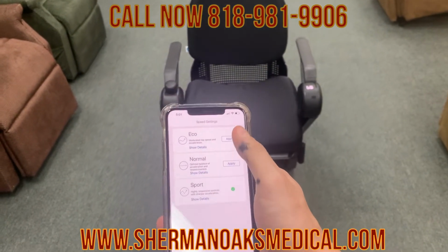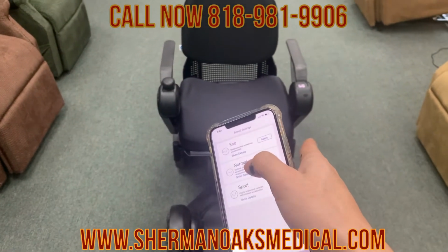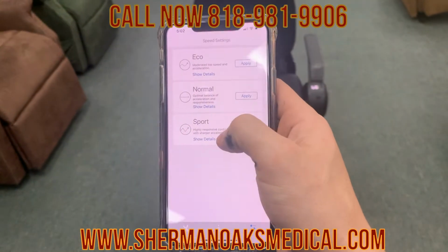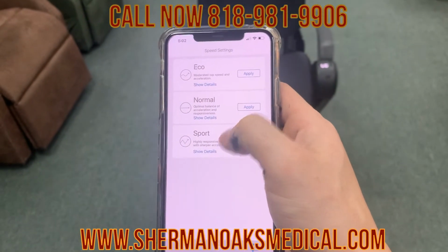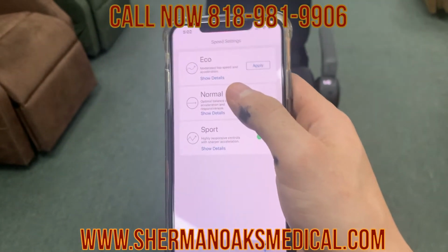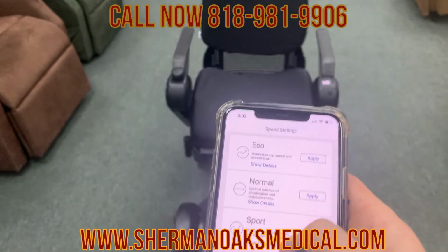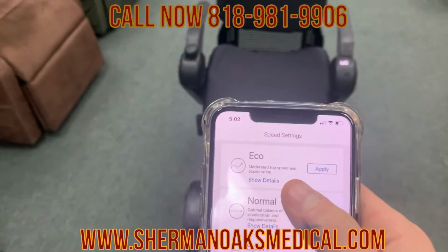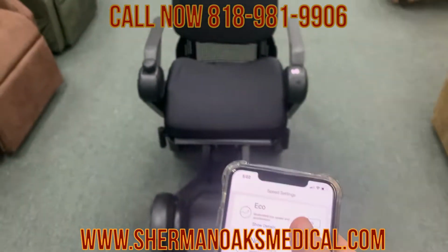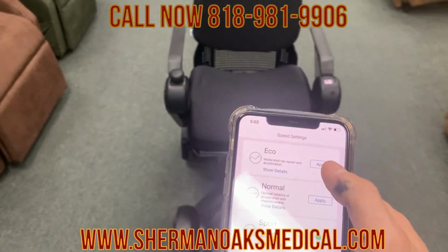Finally, you have your different speed settings. These are relatively different from the ones you have on the console, because that goes 1 to 4. These themselves program the motor in the system. So you have sport, where it will go really fast, which is what it's on right now. You have normal, which is very optimal, so it's not going to feel like it's shifting at all or pushing too hard like sport will. And you have eco, which is very slow, especially at the top speed, but you do conserve a lot of battery. So when running low on charge, that's a good function to use.